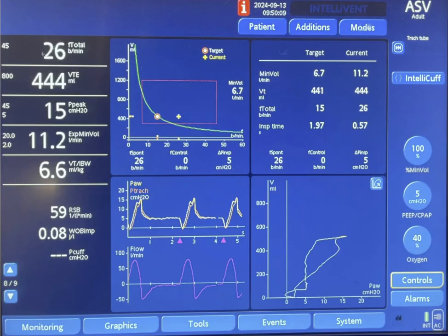You can see this is the respiratory rate of 26 per minute. This is the tidal volume. This is the peak pressure. And this is the minute ventilation here. And this is how much tidal volume per ideal body weight.